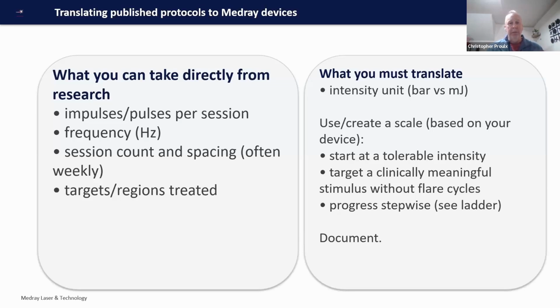So I had someone ask me about, oh, I don't need presets because that means I'm not a good clinician if I don't know which one to use. I'm like, yeah, you just really kind of need more of a basic understanding in terms of more energy, less energy. Do I need a frequency setting? Do I need it to be continuous? What are your wavelengths? What are your favorite wavelengths? What do you want to use for various types of conditions, right? Knowing the 4011 protocols that I developed for the products doesn't make you a good laser clinician. It makes you a laser specialist, which is a little bit different. But with shockwave, it's a little easier.